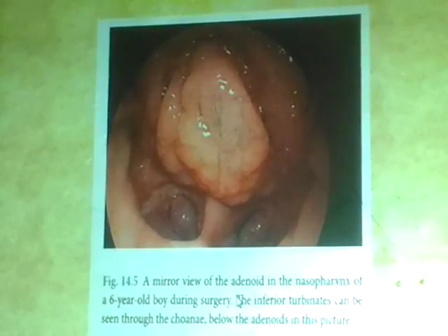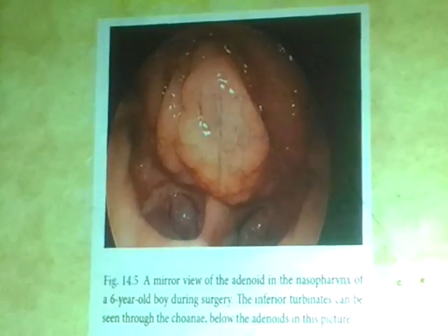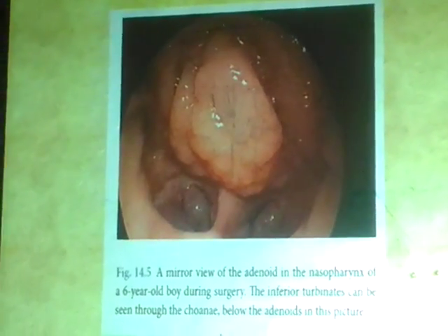This is a mirror view, intraoperative mirror view.